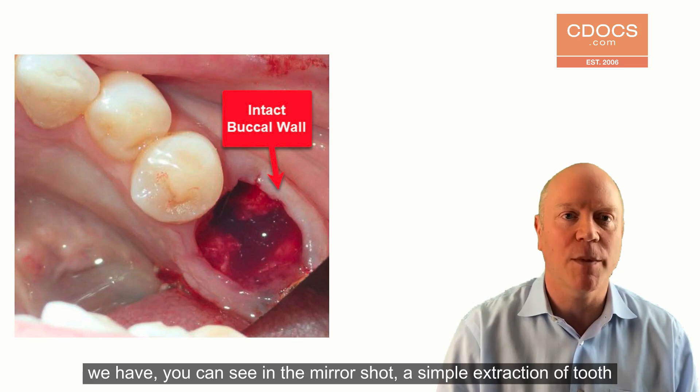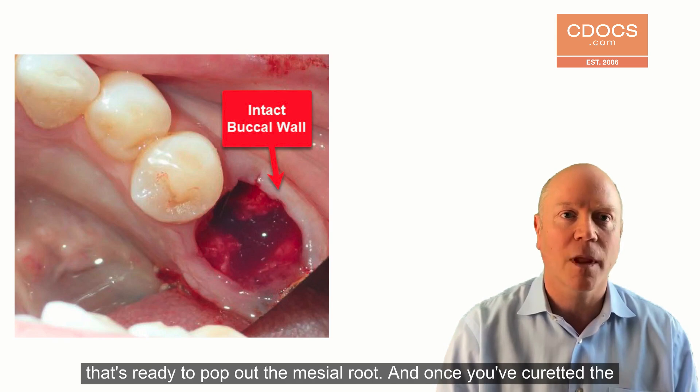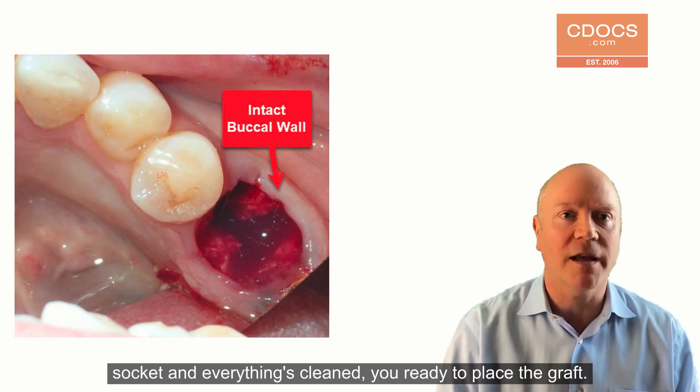Here we have, and you can see in the mirror shot, a simple extraction of tooth number 19. The walls are intact. You can see a little defect in the interceptal bone — a pop out of the mesial root. And once you've curated the socket and everything's clean, you're ready to place the graft.